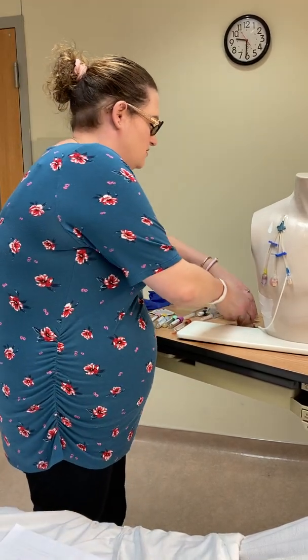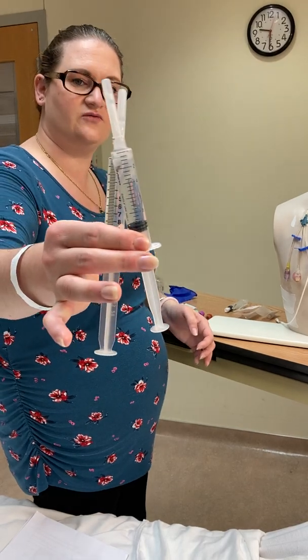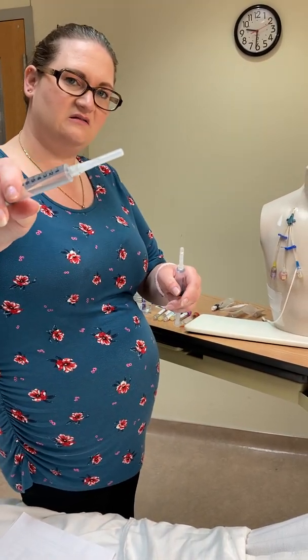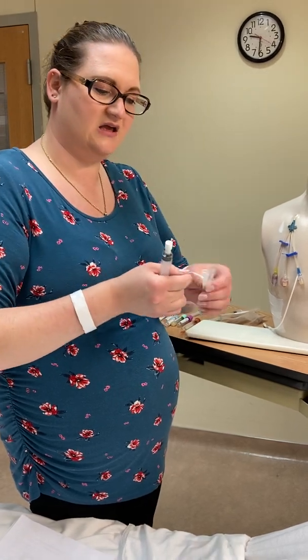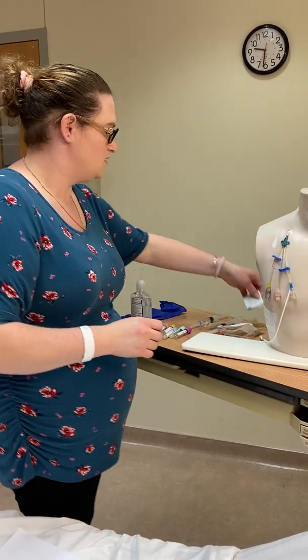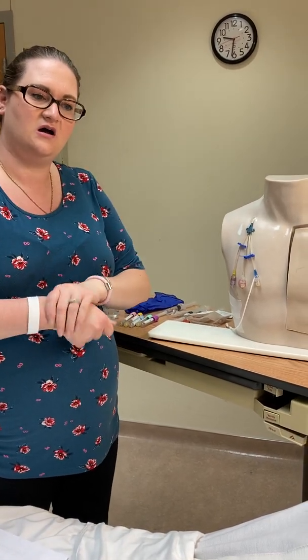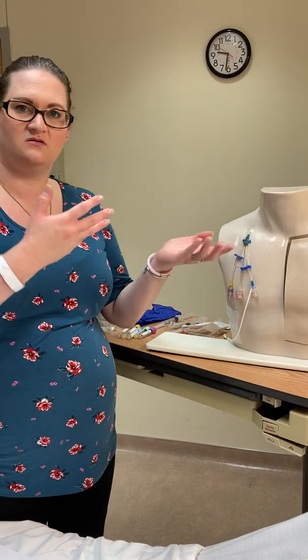For supplies you'll need an injection cap, because you'll change that at the end of the blood draw. You'll need a blood transfer device, two full syringes filled with saline, and if you're using a simple connector you'll need blunt tip cannulas on the end. You'll also need an empty syringe for the sample, three to four alcohol swabs, and clean gloves. A mask is typically required now per pandemic policy.